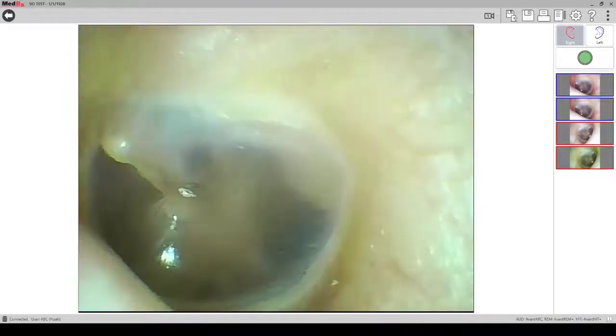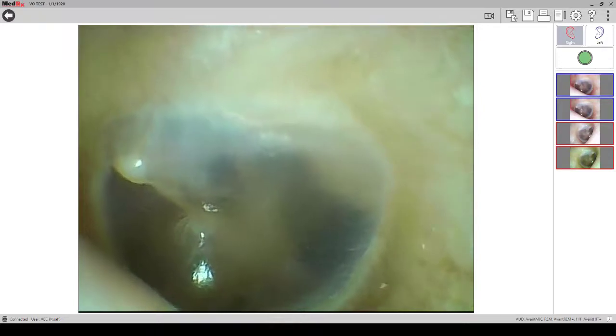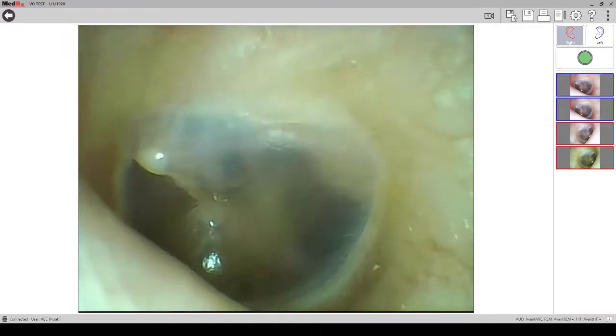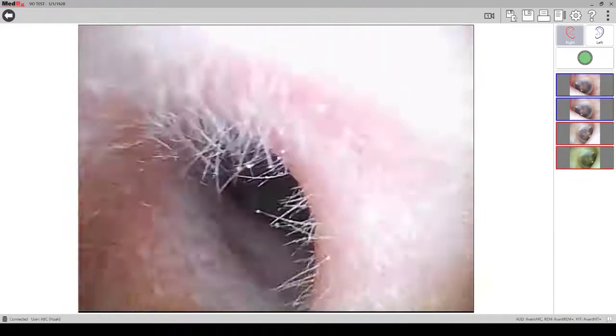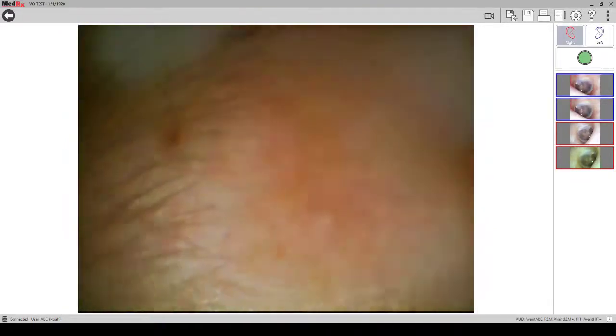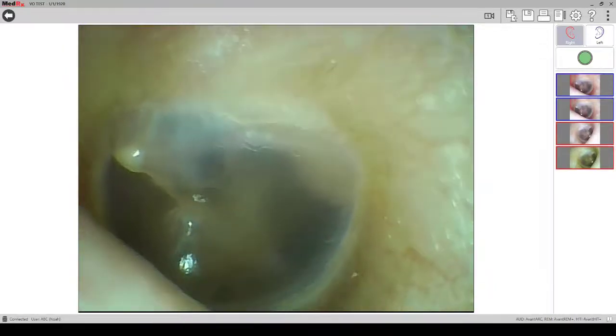When placing the otoscope in the patient's ear, remember that the otoscope has a close focal point, so the image will get clearer as you get deeper into the ear canal. Also, the otoscope has an auto white balance feature, so the colors will change as you move the otoscope in the ear canal.